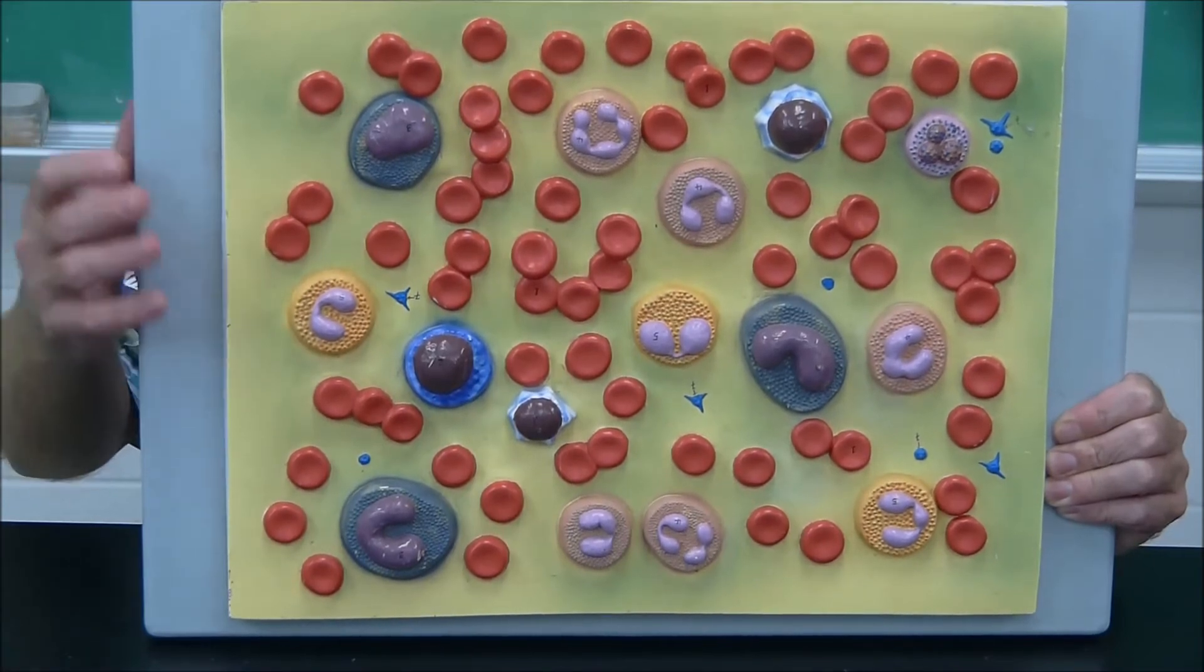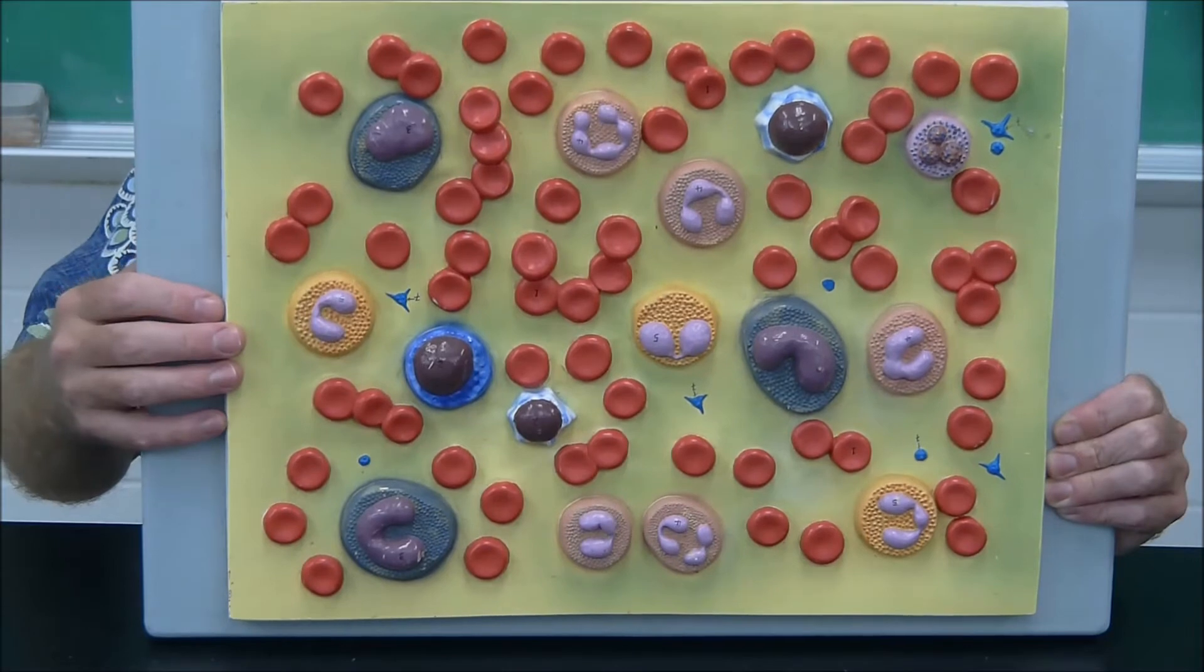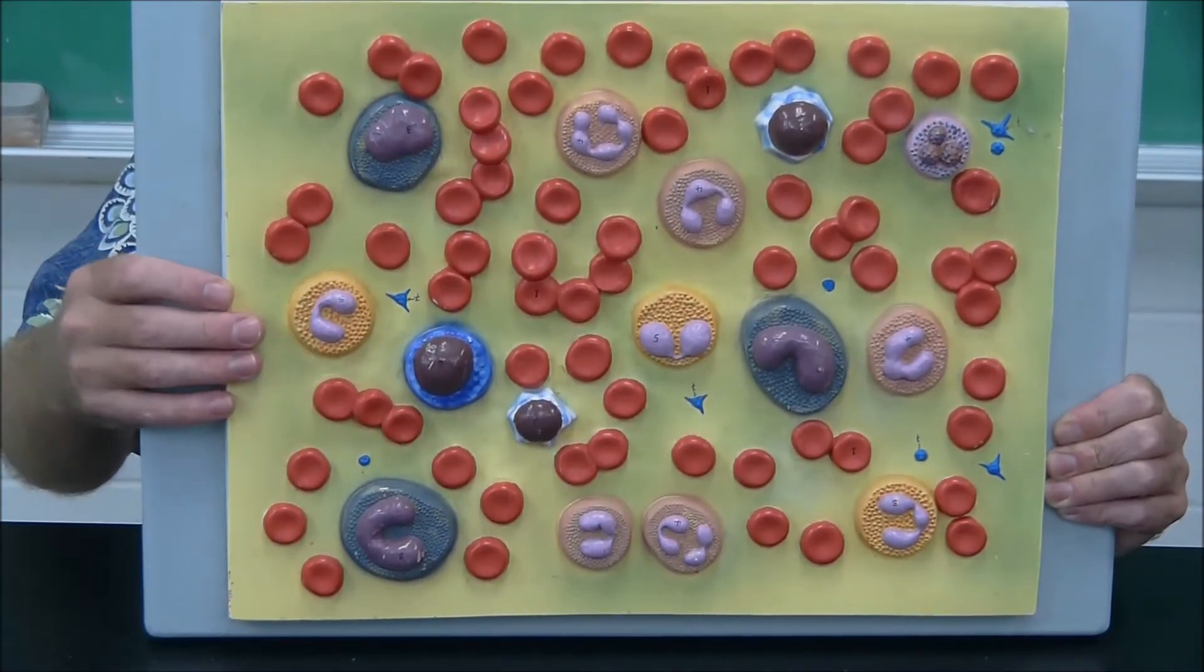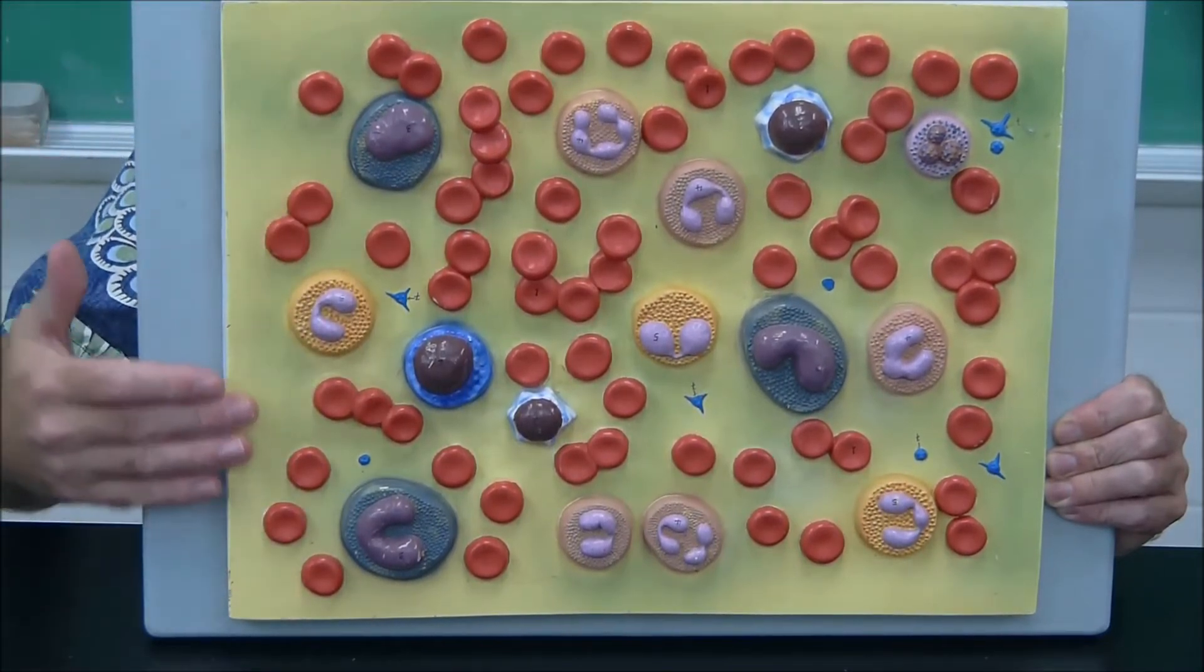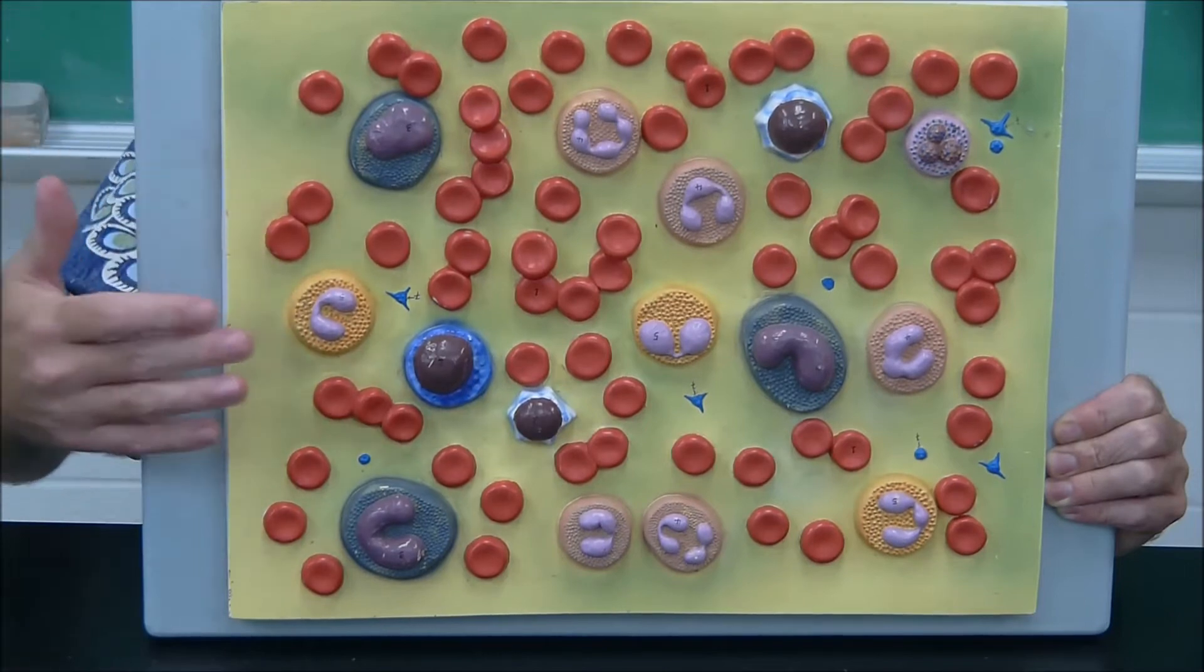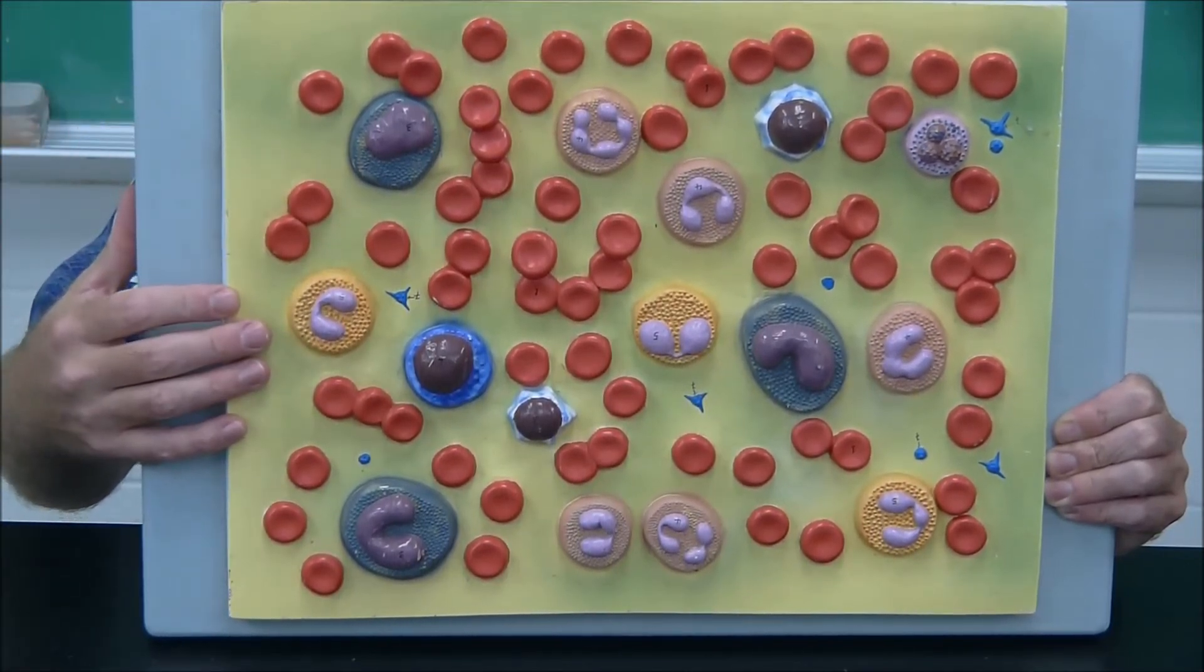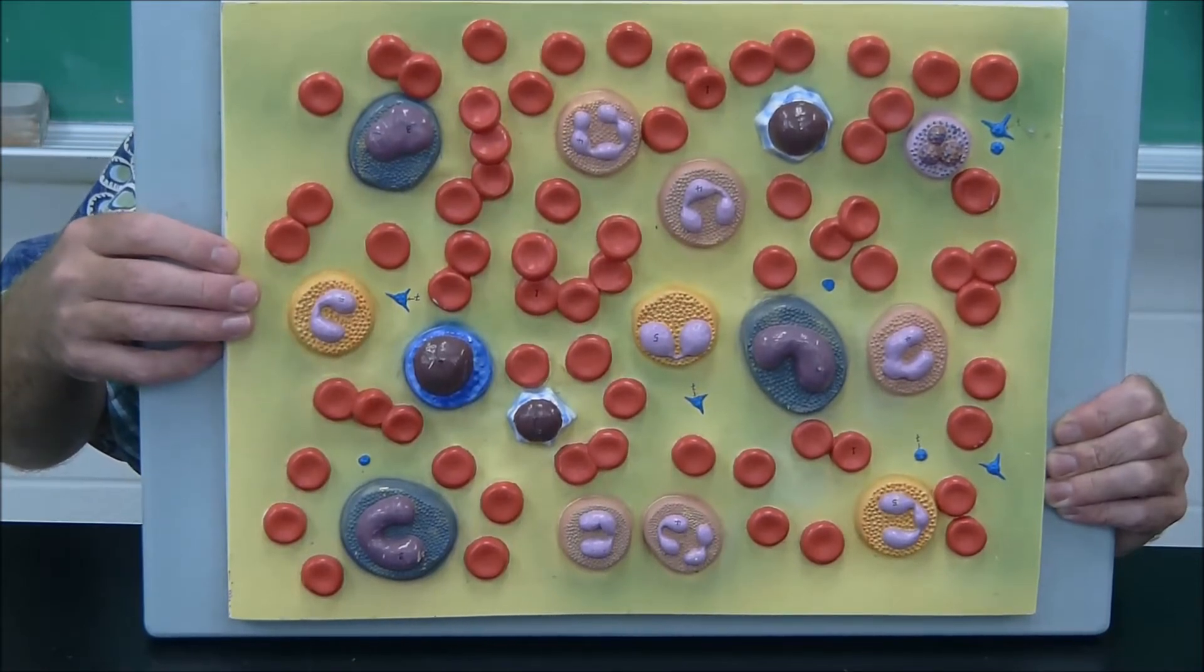In a differential white blood cell count, we count 100 white blood cells and see what proportion are neutrophils, eosinophils, basophils, etc. You would never see this many white blood cells in one field of view under the microscope, but it's here to help us learn how to make a differential count. What I want you to do now is look at the total number of white blood cells here.